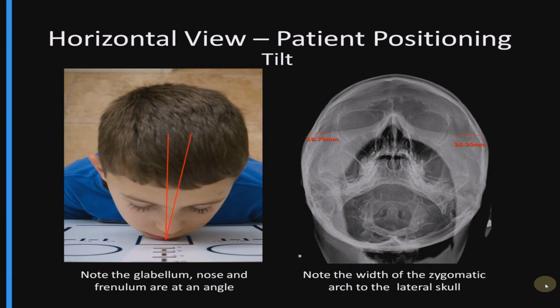When looking through the top of the patient for horizontal tilt, if there is head tilt occurring on this film, there are two main ways we assess for that. One, we put our fingertips underneath the patient's mastoid, point our fingers towards each other, and see if the line on the bottom of the mastoids that our fingers are representing is parallel to the central horizontal line on the Bucky.